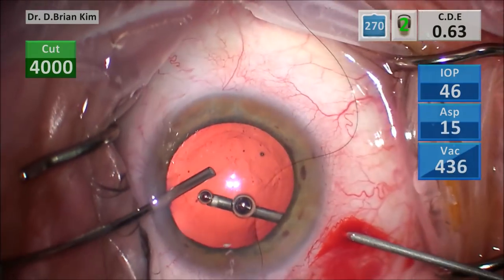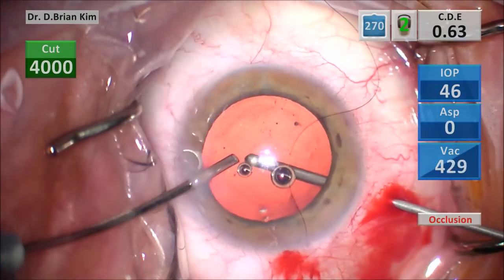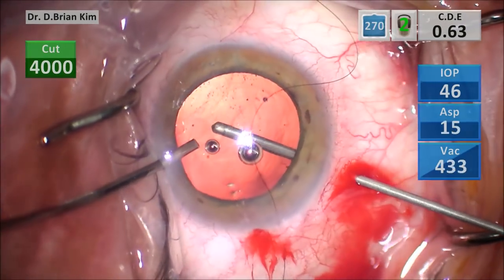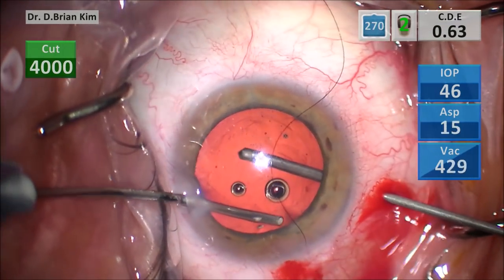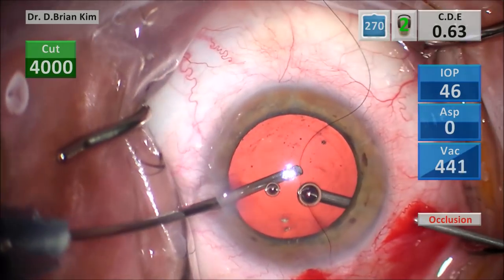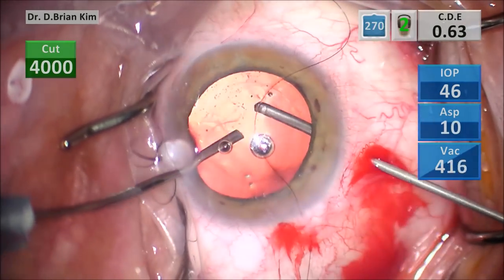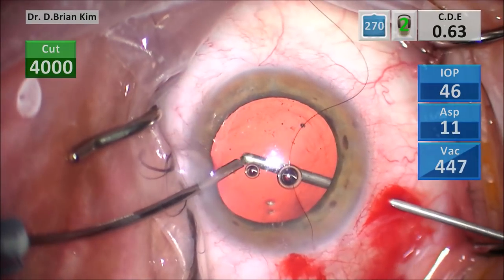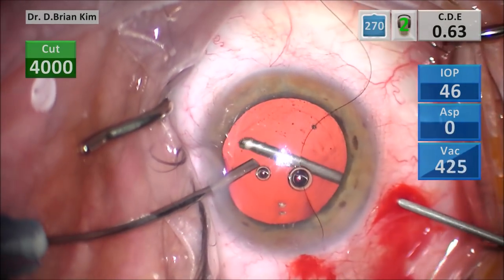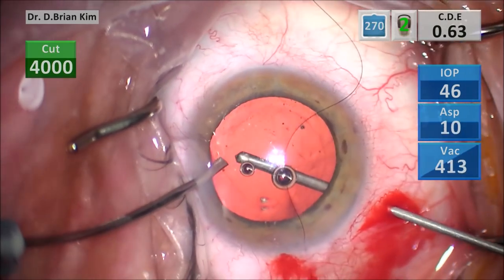I'm using the vitrector in the pars plana, but I'm using my irrigation in the anterior chamber, the paracentesis site. And I use it here to sweep the wounds, which will help ensure there's no vitreous to the incision. And so you just want to take your time doing this.